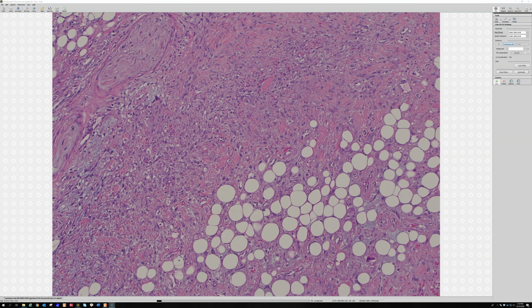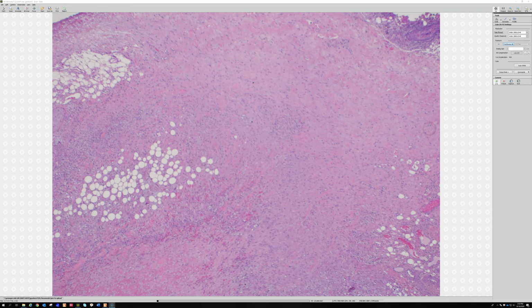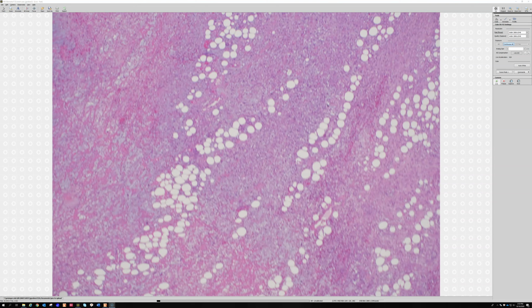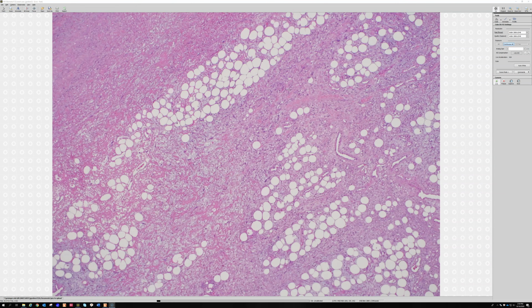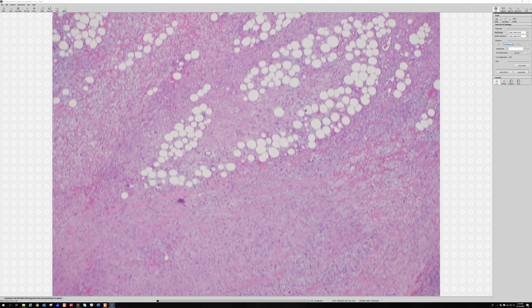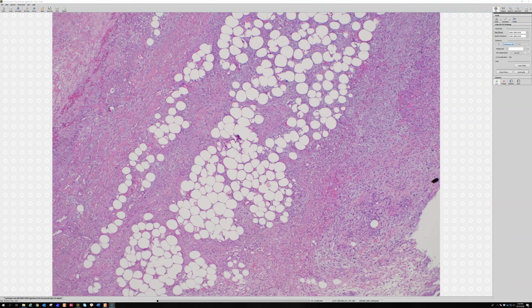So it feels like there's a clinical pathologic correlation, but both sides are wrong, right? It clinically looks more scary than it is, and microscopically. So that is called ischemic fasciitis. And again, recognizing the loose myxoid fasciitis-like stuff in the background, that pattern is what really helps me a lot, in addition to the zonal pattern.